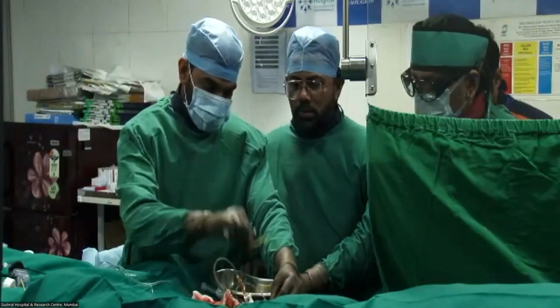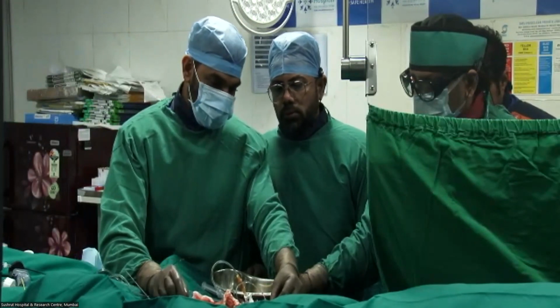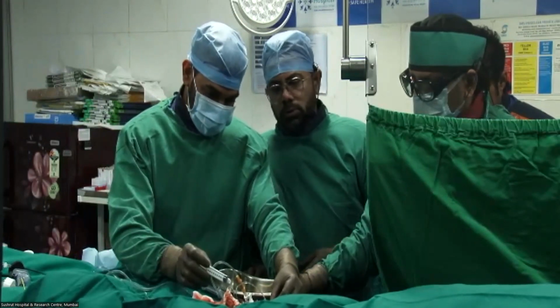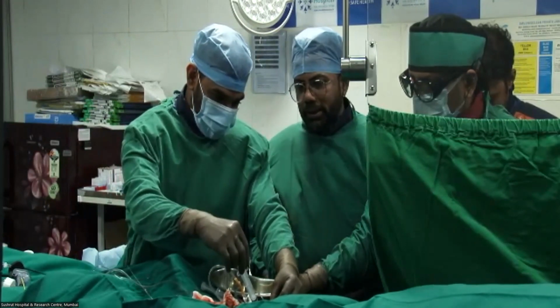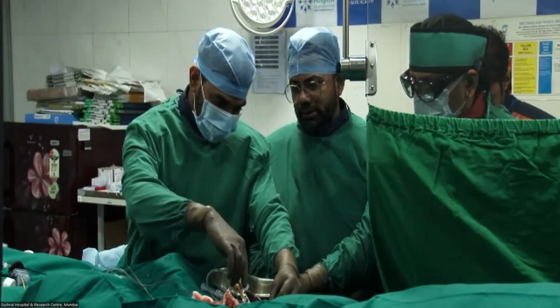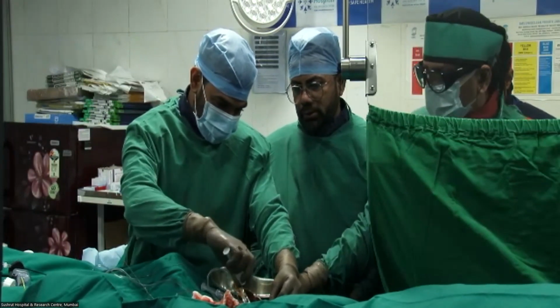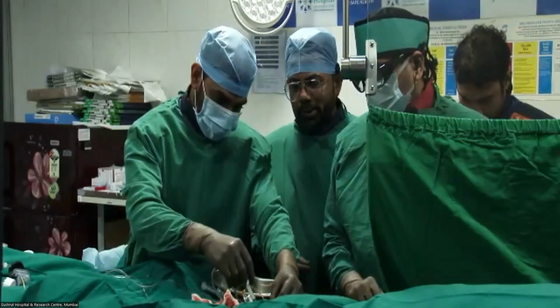Manish, one point is very clear. In double stent strategy, there is no question KBI is required. In provisional stenting strategy, if there is a flow reduction, you have to do a KBI. Otherwise, people try, depending upon their chance of crossing over. If you cross over, if you do a balloon dilatation, finally you have to do a kissing. If you don't do a balloon dilatation, only keeping a wire, you get a TIMI 3 flow. Just leave it. Okay, sir. Thank you.